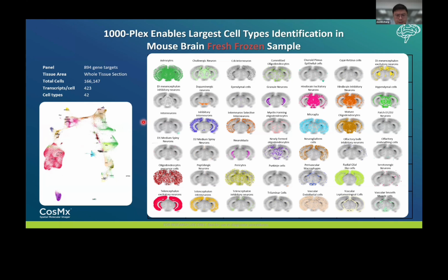But if you run on CosMx, then you do get the signal, and you're able to identify the different cell types and where they are distributed in different regions on the tissue. So you have an example here: different cell types are distributed at different regions, and different tissue types might also have different cell type abundance on the tissue.